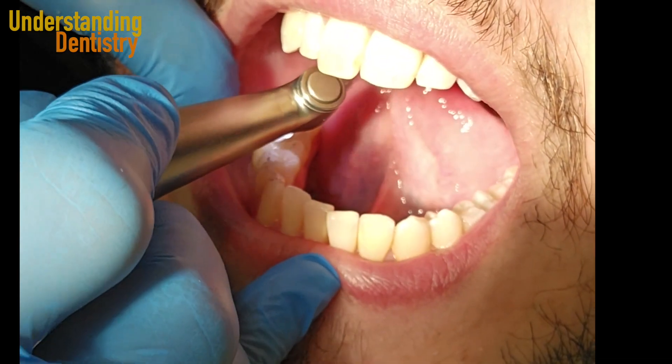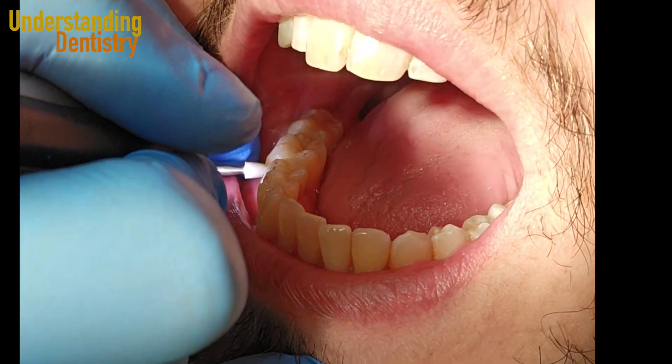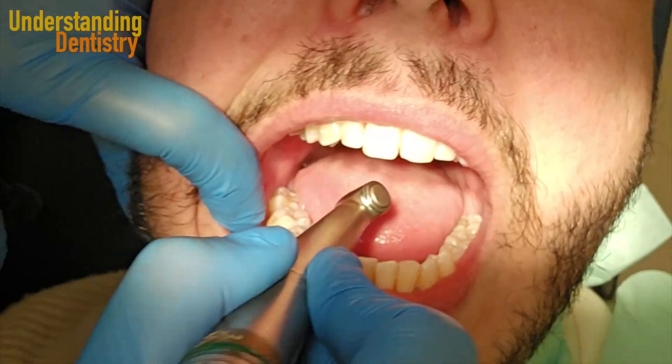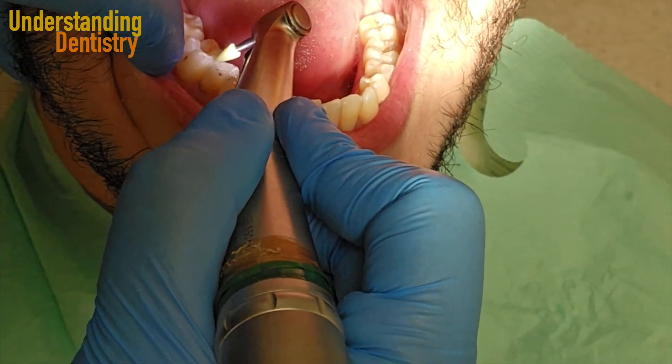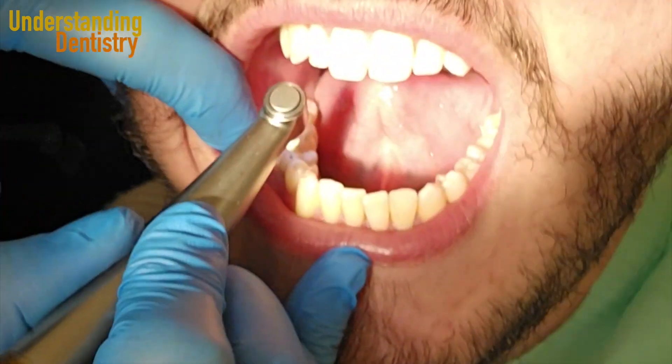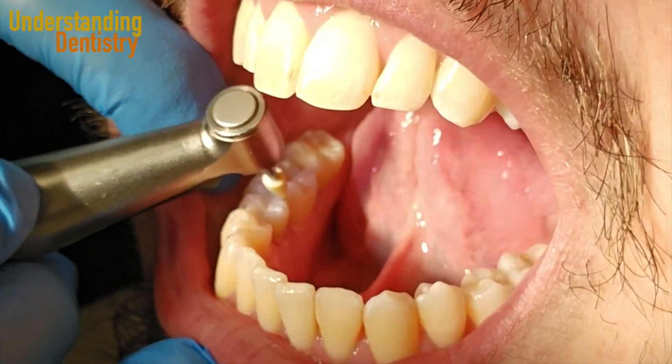Now take a look at this — this is the flame tip, or candle tip, which is very useful. It's very useful to adjust corners and fissures, and then you can use the curve of the flame tip in the internal surfaces of your occlusal surface. This is really useful.